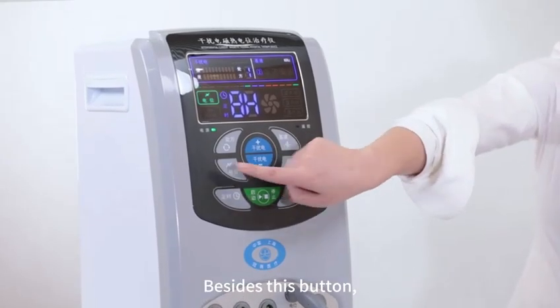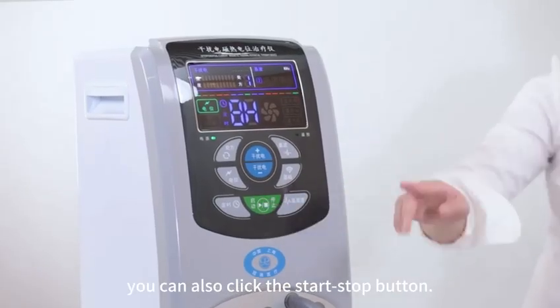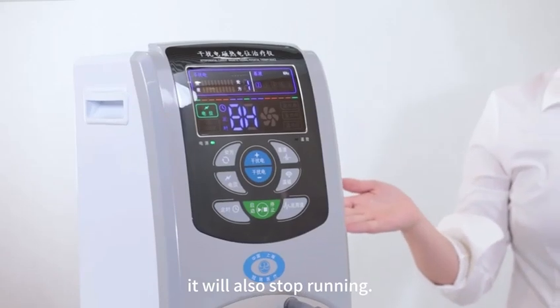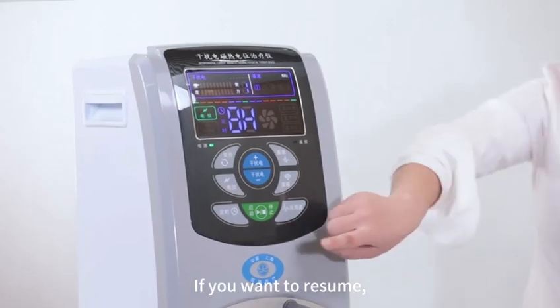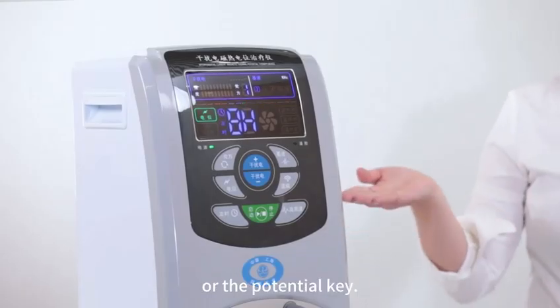Besides this button, you can also click the Start-Stop button. It will also stop running. If you want to resume, you can click the Start-Stop button again, or the potential key.